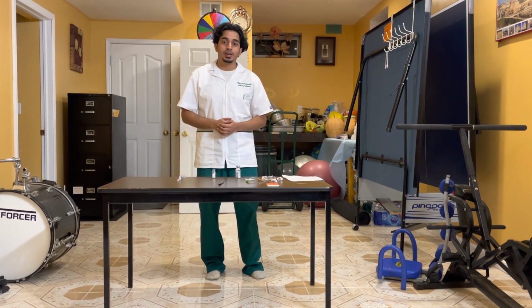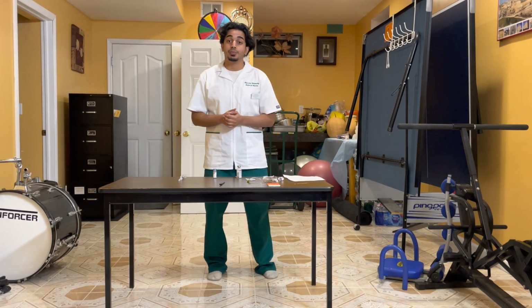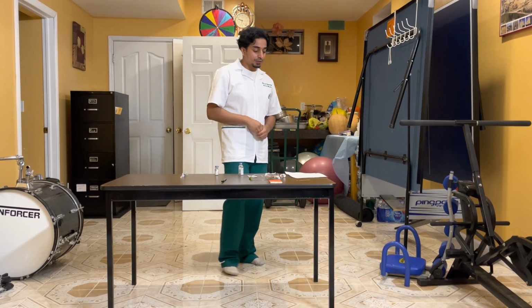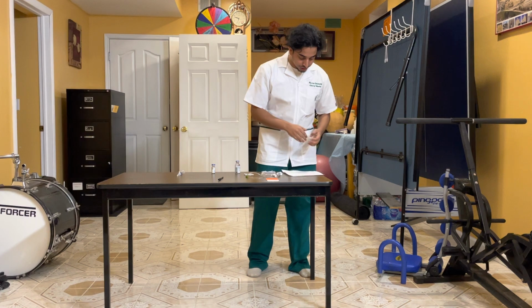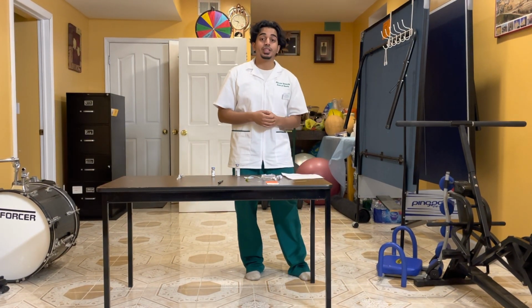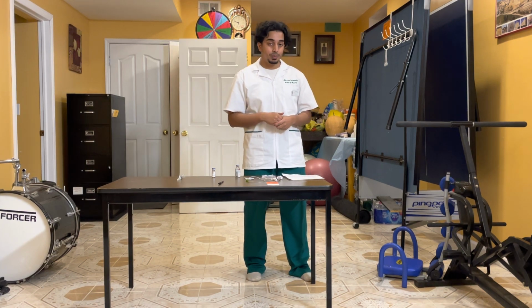Okay, hi. So today I'm going to be doing the IVPB medication administration. Currently I'm in the medication room and I'm going to first be making sure I have the right patient. Mrs. Durbin, date of birth is January 17, 1930. I'm going to be looking at her MAR and her EHR.